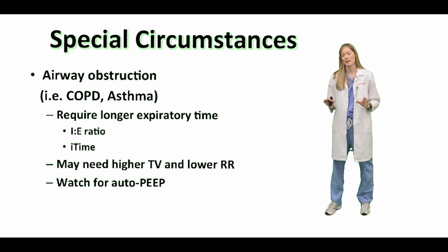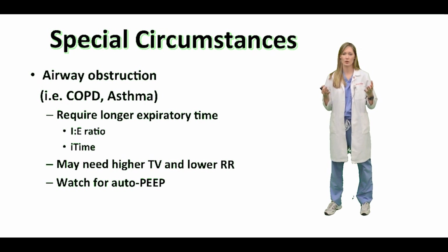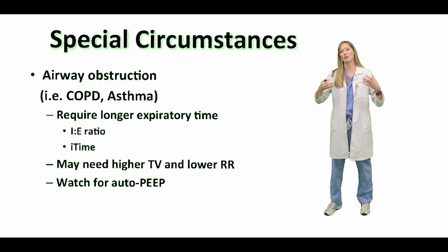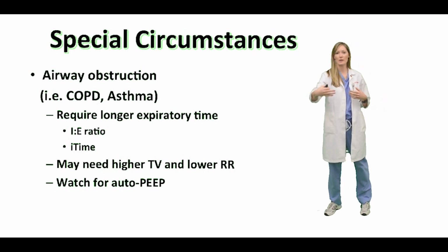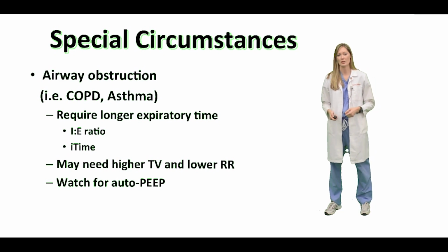If you see that happening on the ventilator, what you want to do is turn up your tidal volume and actually decrease your respiratory rate. So even though they're taking a bigger breath, they could potentially have more time to exhale. You may need additional sedation for these patients as well.